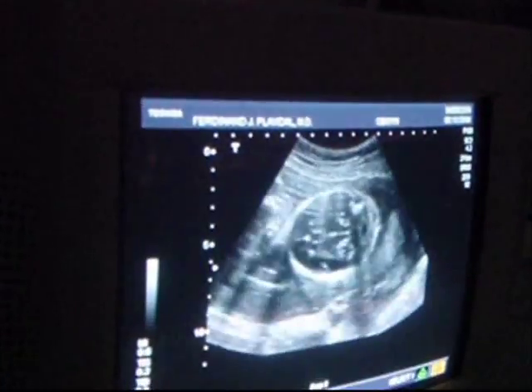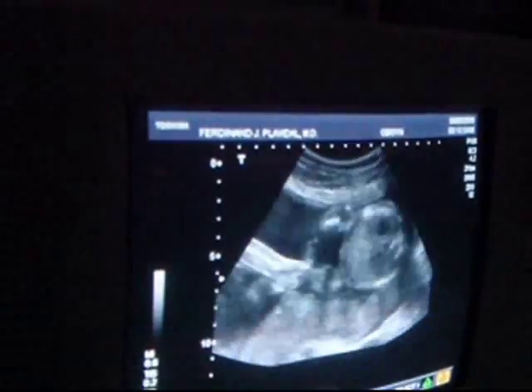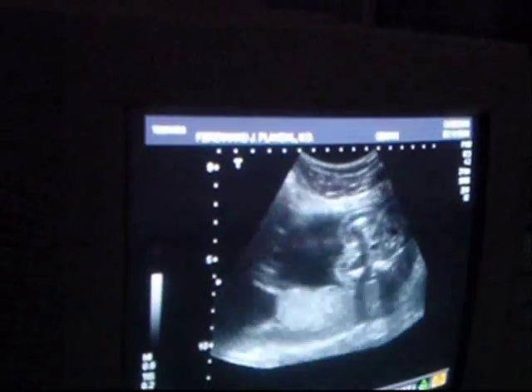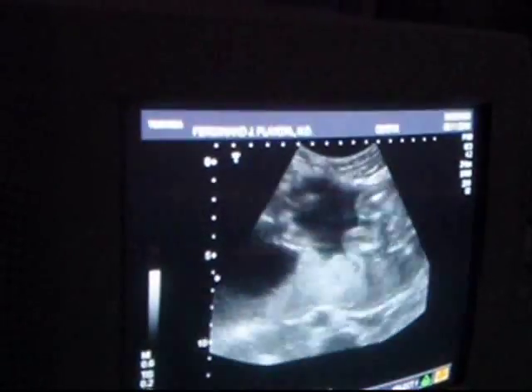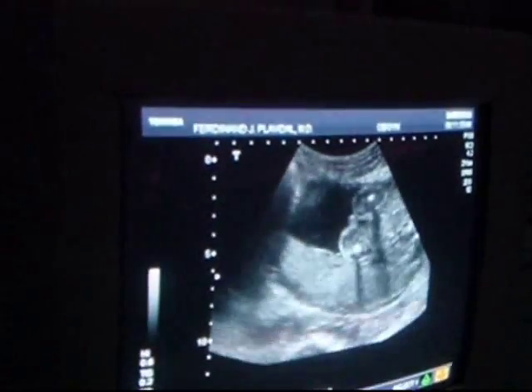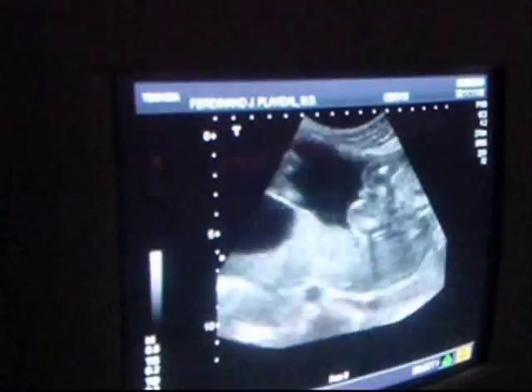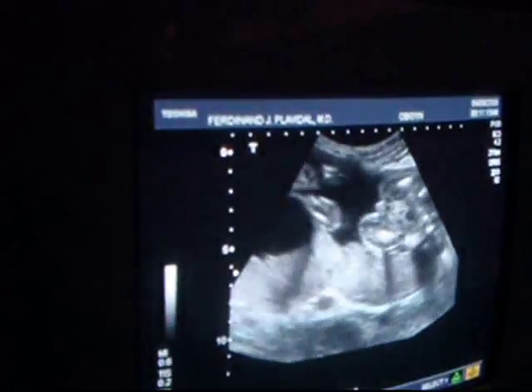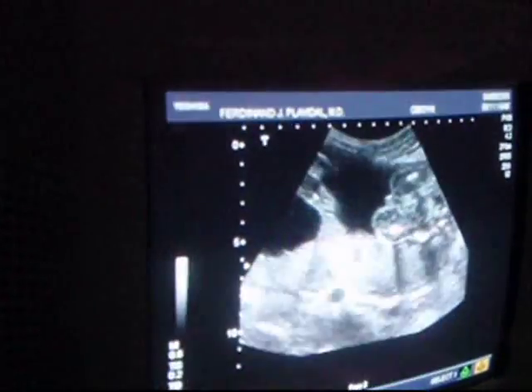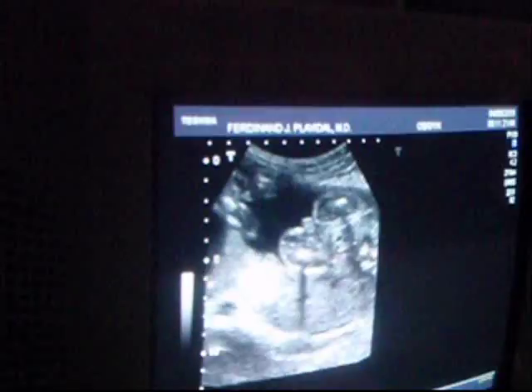Baby B, we're going to call today over here on the right side, is head down also, coming up through the chest, and there's our chambers of the heart. Beautiful looking abdomen. Here's a rear end on this baby here, and this looks like a boy over here. So am I good? Am I consistent? Yeah. Okay, good. Yeah, because there's something sitting right here between those legs. Not real impressive. Don't take it personally, but that looks like pretty obvious boy parts right there. That's my thought.